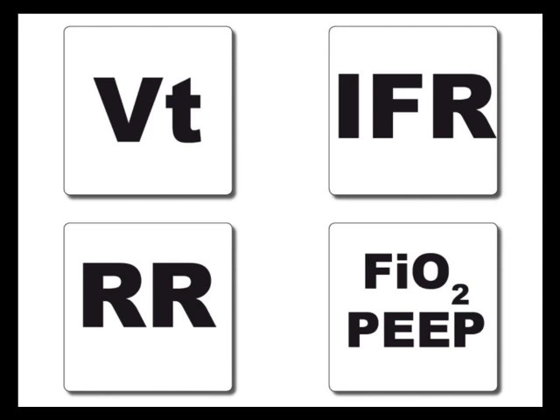Most important dials, respiratory rate, start at 10. Either check your flow waveform or your plateau pressure. If either of those look screwed up, go down on your respiratory rate. All you need to oxygenate a patient, which is what you really care about during this period of time, is just a couple breaths a minute. So if you have to knock them down to 8 or 6, it's okay. Remember, continuous nebulizers and a good sedation package.